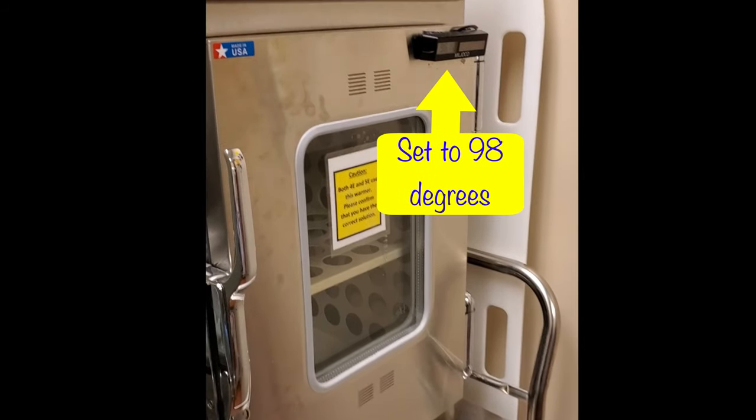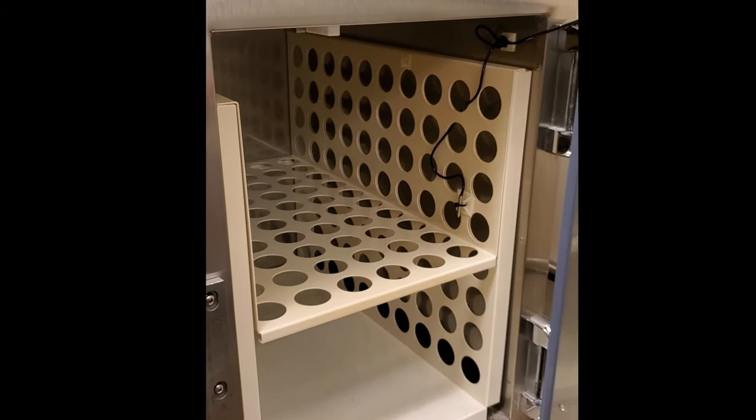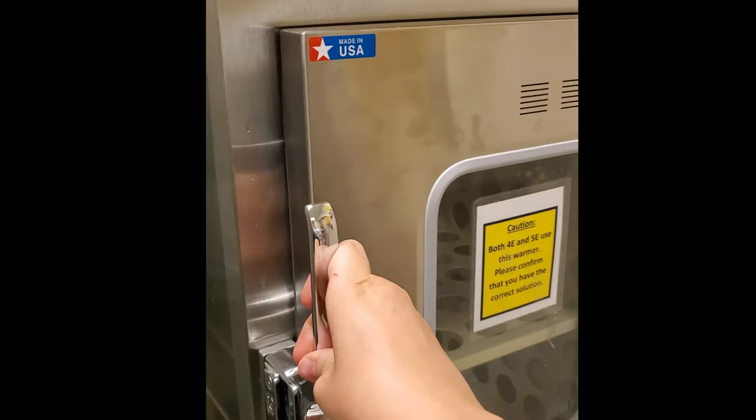Another option is to use the fluid warmer located on 4 East. It's set to 98 degrees, so you don't have to worry about overheating your fluid. You can leave your dialysate in the warmer for an extended period of time and retrieve it prior to performing dialysis.